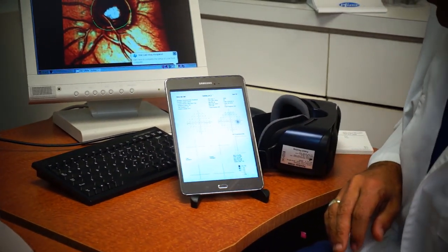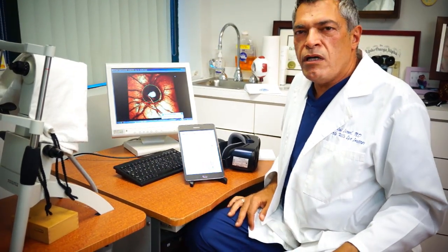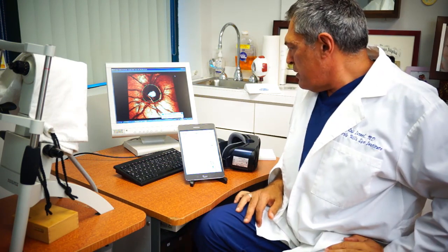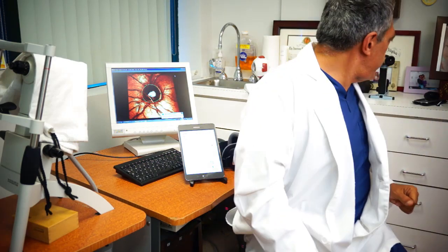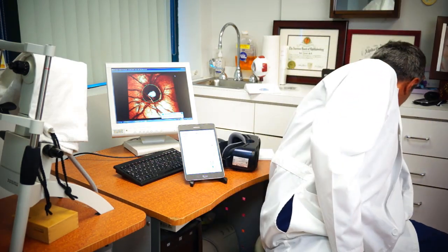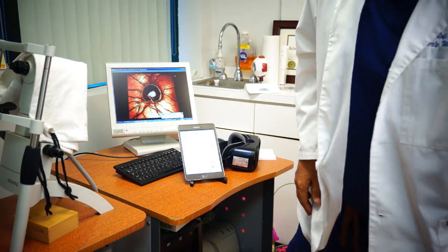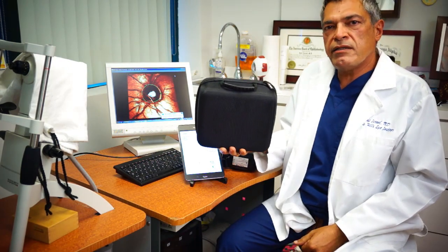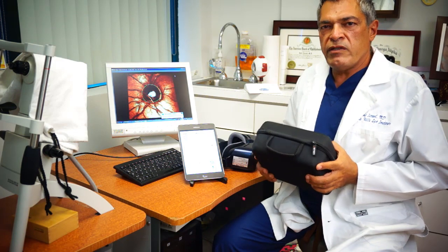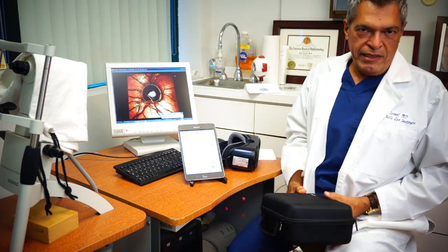The reports can be printed or saved directly to your medical record software. Basically, this is how simple it is. The entire device comes with a carrying case — you can transport it safely from location to location. This is again Dr. Rafi Israel. Thank you very much.